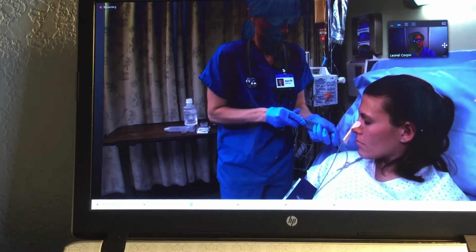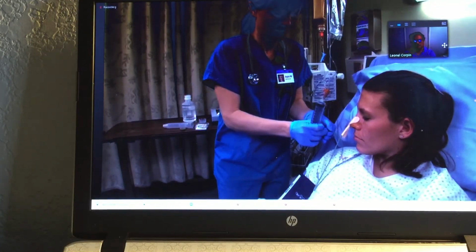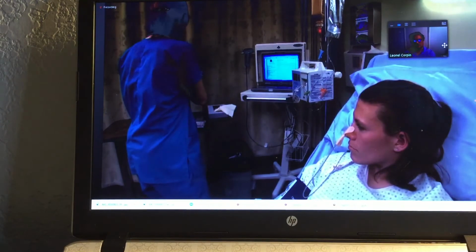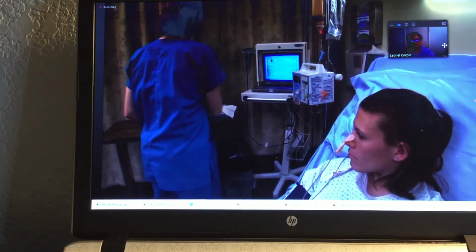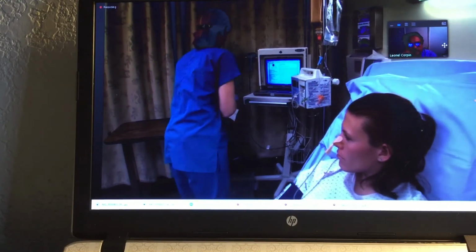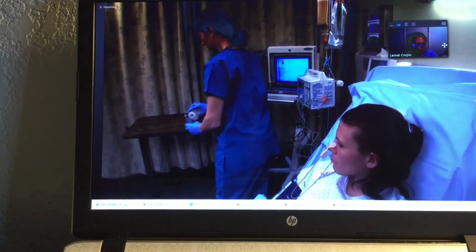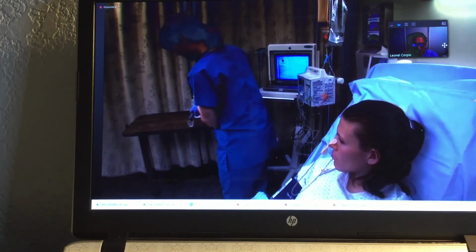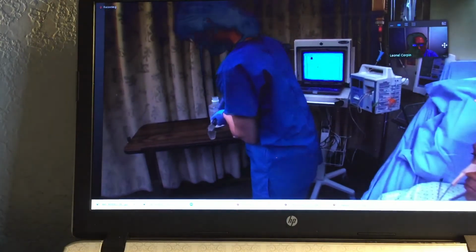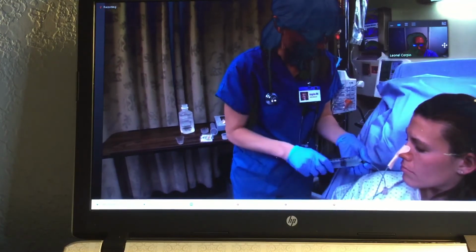Follow your facility's policies and procedures for returning aspirated contents to the stomach. Contact the provider about excessive residual, typically more than 250 milliliters, or when the tube placement is in question. Just going to flush the tube, and then we'll go ahead and start your tube feeding.